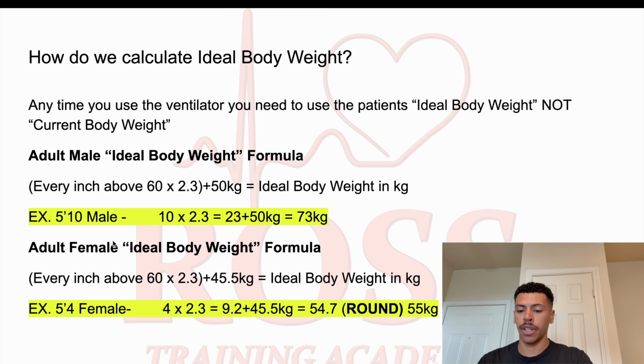For women, you're going to go ahead and use their ideal body weight formula, and not much is going to change except for the second half of the equation.